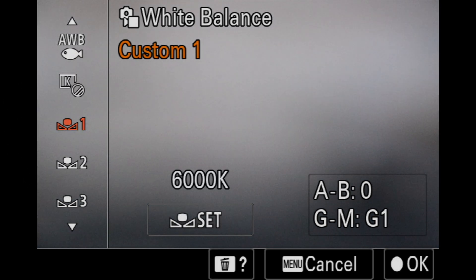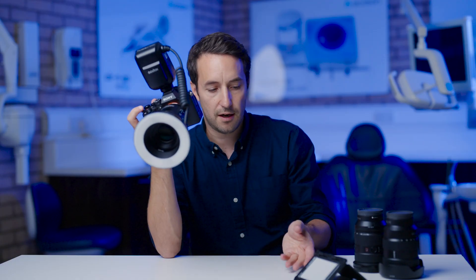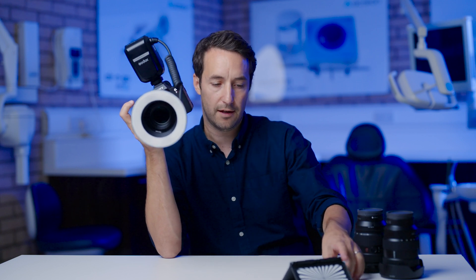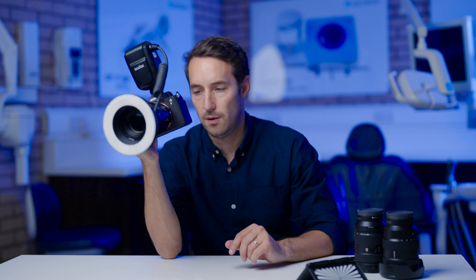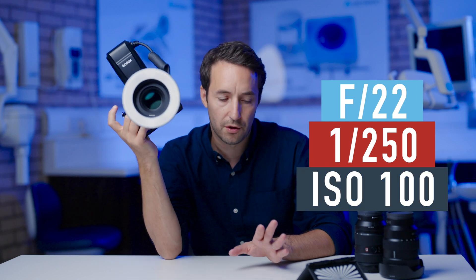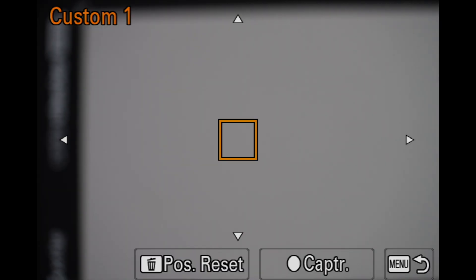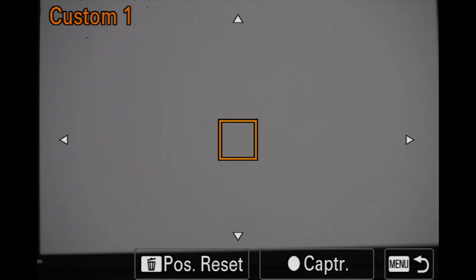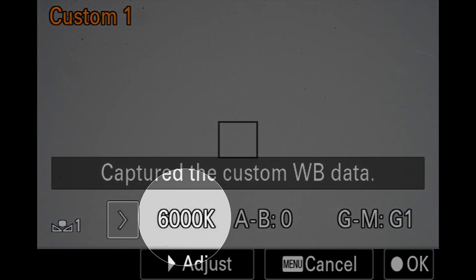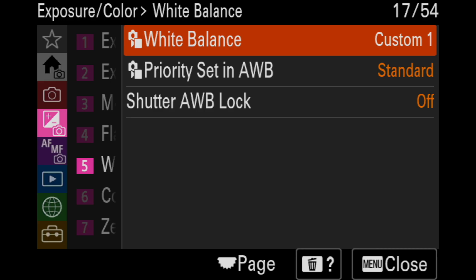Go into set, select set, and then what we need to do is get our grey card or piece of white paper. Remember, you've got to set your camera up in exactly the same settings you're going to be taking your pictures on. So I'm on F22, 250th of a second, at ISO 100. I'm going to aim it towards this grey colour checker, select in the middle there. This has captured the white balance data and it's given us a Kelvin temperature of around 6,000 Kelvins, which is about what I'd expect.